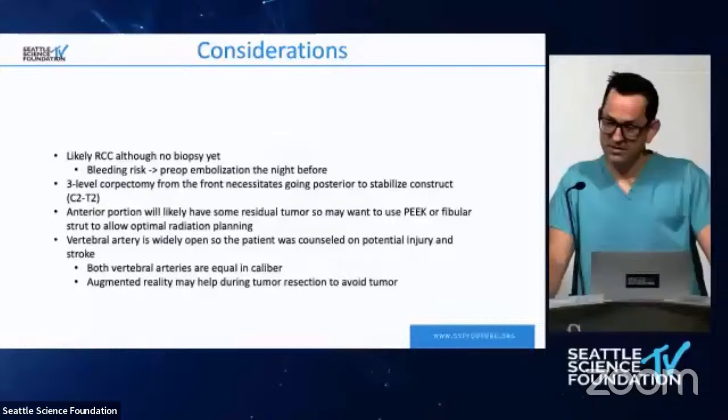Yeah, because his alignment's fairly reasonable. He does have vertebral body collapse, but he's not very kyphotic there. So that's one thing, alignment. I'd prefer this if I have to do a multi-level or complex anterior resection. The instinct is so strong to go in the front, take that out and replace it. But the bone stock here is very impaired, and when we get into a multi-level situation, mechanically it becomes very unsteady.